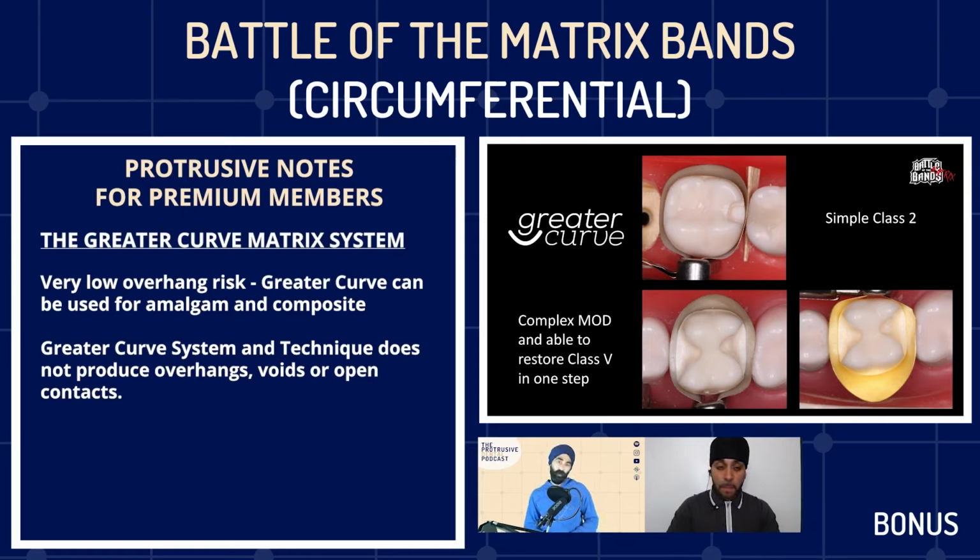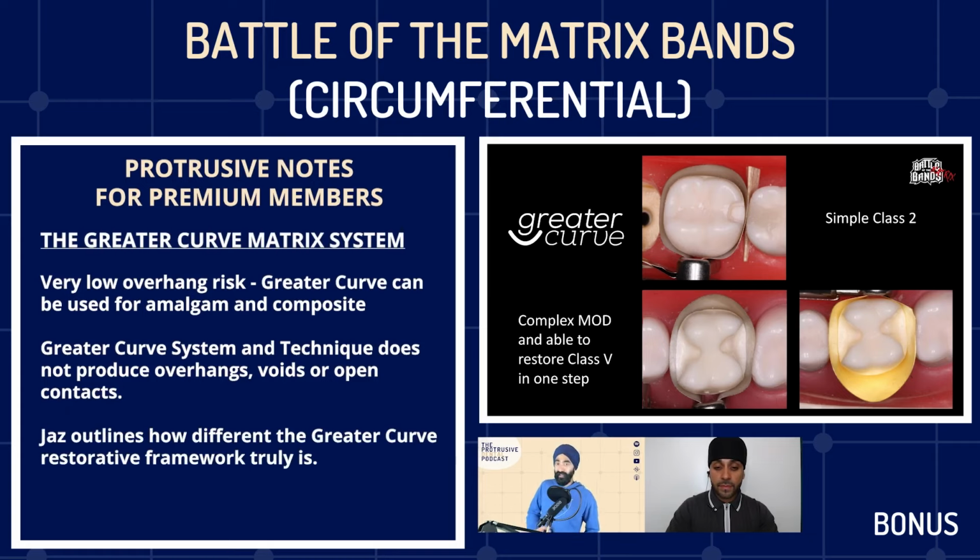Okay, cool. So the photos speak for themselves. The contact just looks flared out. You can see that the band is actually contacting the adjacent teeth. The thing that sits uneasy with me still to this day, Sonny, is I'm so used to using a wedge. It feels alien not using a wedge. But the few times I've done it, fine, I get it. I can see why, because the apical seal is so damn good.